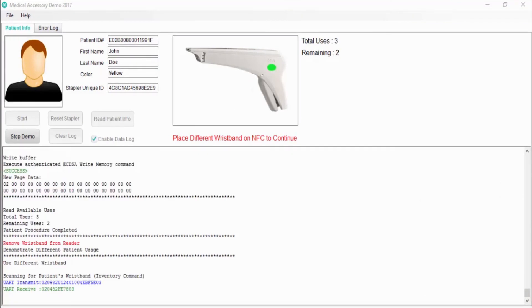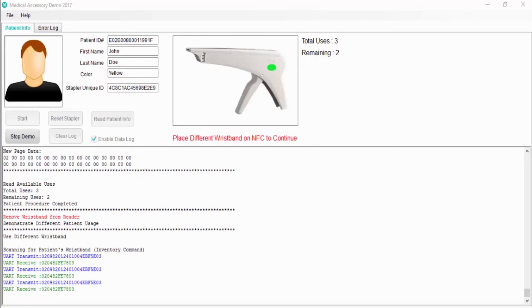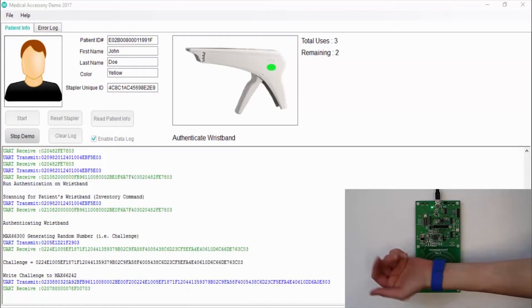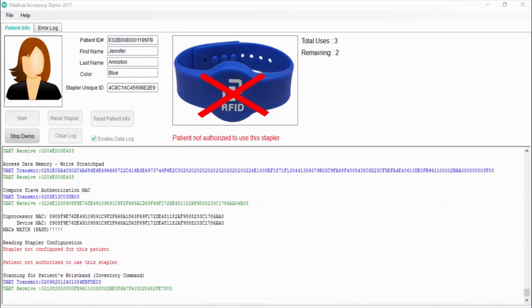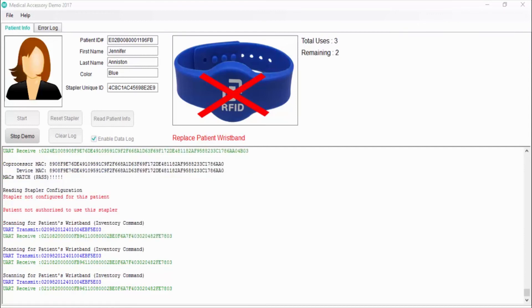I am using the blue wristband, and this can represent a second patient requiring a procedure with the same type of accessory. It is possible that a mistake could be made when the person providing the treatment incorrectly tries to use the stapler assigned to the previous patient. The software authenticates the patient and gets her information. The software reads the patient's ID from the wristband and compares it to the patient's value securely programmed into the stapler. In this case, the software detects the stapler has been assigned to a different patient and stops the procedure, preventing the disposable from being used again by mistake.